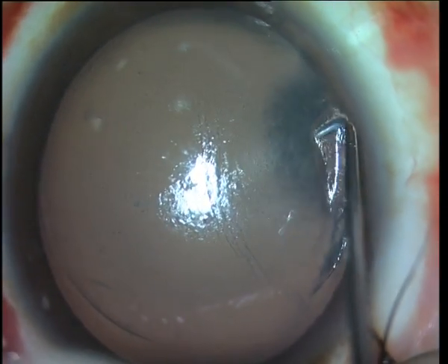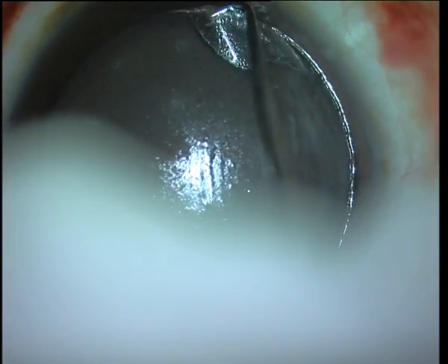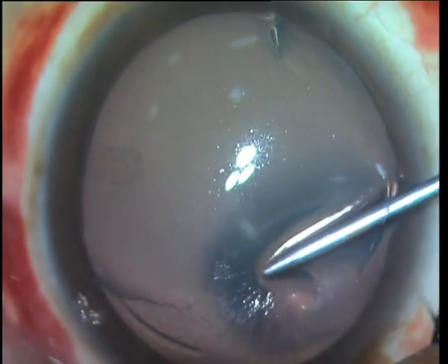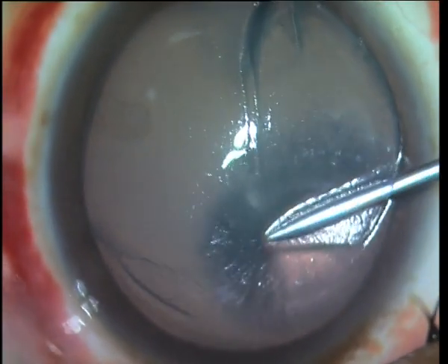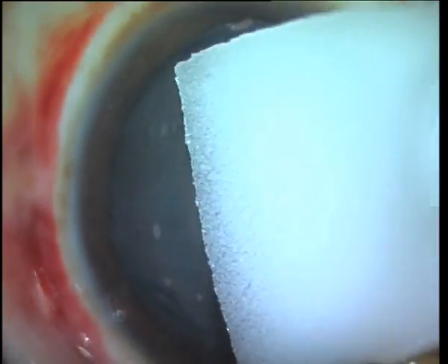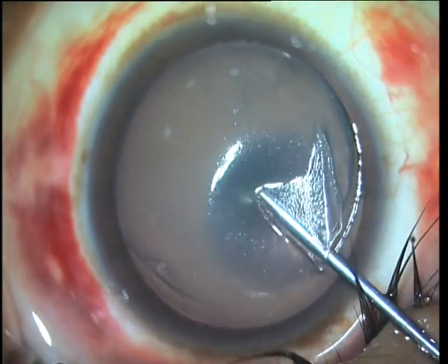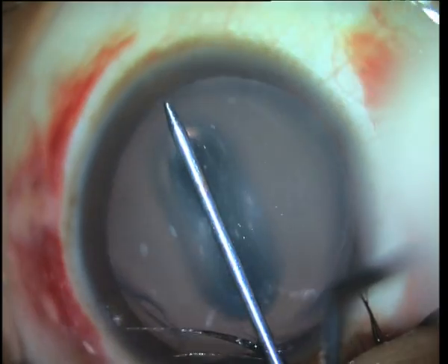What I'm doing here is straightening out the striae very carefully, separating the flap, making sure not to get any epithelial defects. I also lift up the flap as far as the area of striae. I next take a moist Weck-Cel and try to straighten out the striae with the moist Weck-Cel, then stretch it out and flatten it out with a blunt rod.